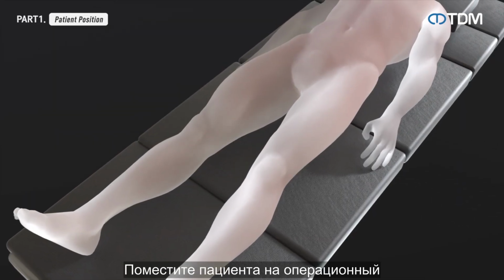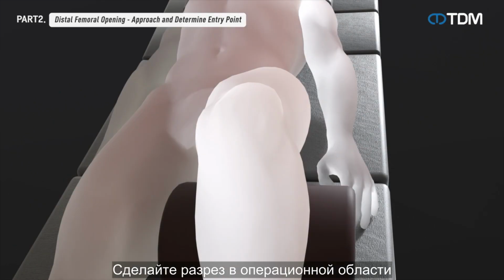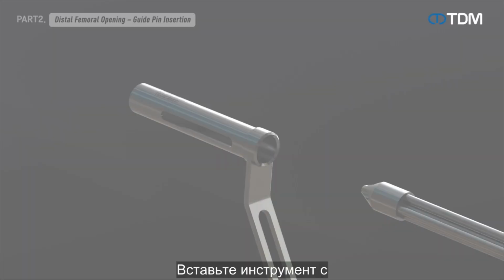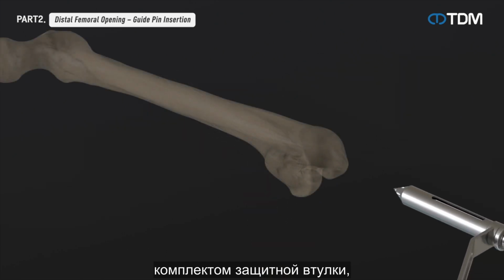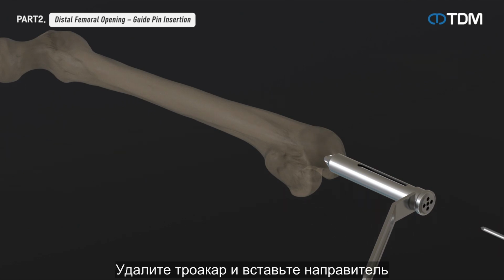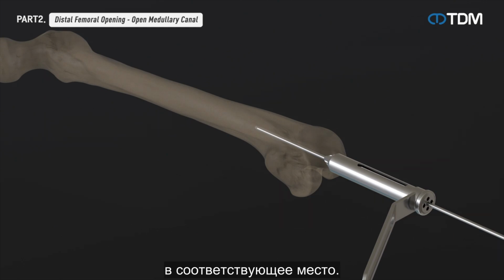Position the patient in the supine on the table for surgery and secure the knee of the surgical site properly. Make an incision on the treatment area and place the guide pin in the center of the distal femoral cavity. Insert the instrument with the combination of protection sleeve, drill sleeve, and trocar into the incision to position the guide pin to be inserted. Remove the trocar and insert the guide pin combined with the electric drill or guide pin holder into the appropriate location.